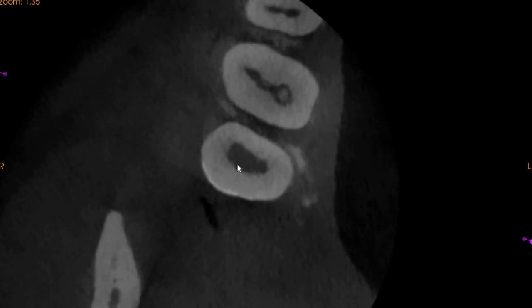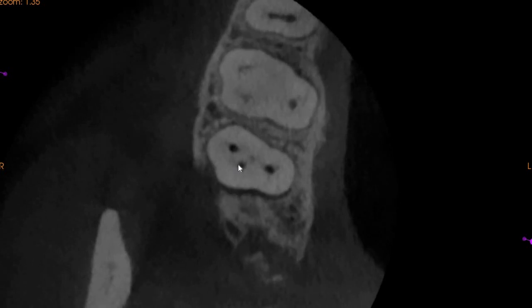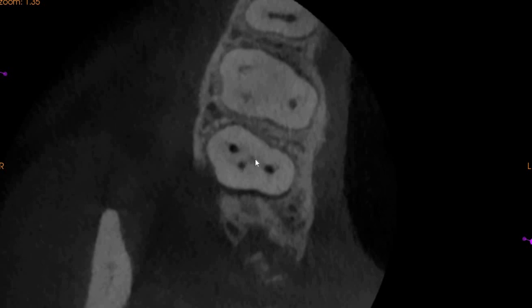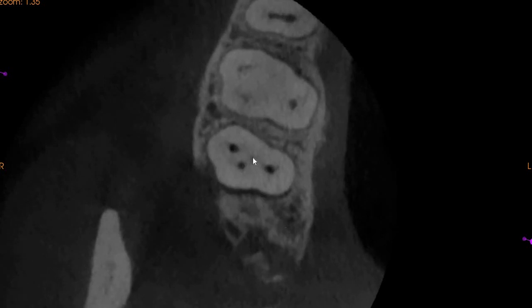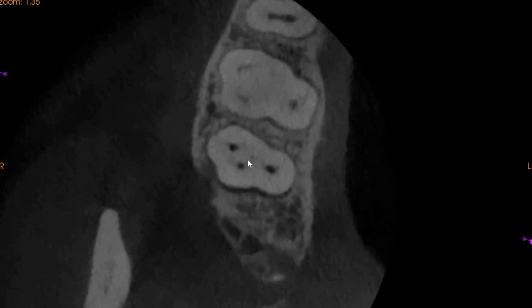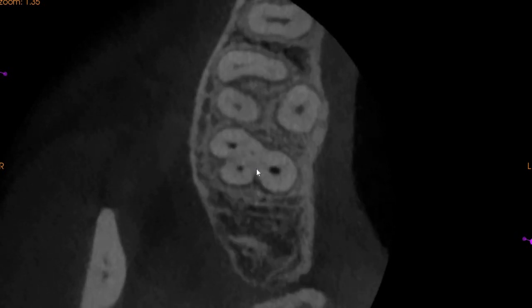As we move further down, we have a very interesting canal configuration. This is the palatal, this is the mesio-buccal one (MB1), this is the mesio-buccal two (MB2), and this is the disto-buccal. They are all very close together. The MB1, the disto-buccal, and the palatal appear to be prepared, whereas the MB2 does not seem to be prepared on the axial view.